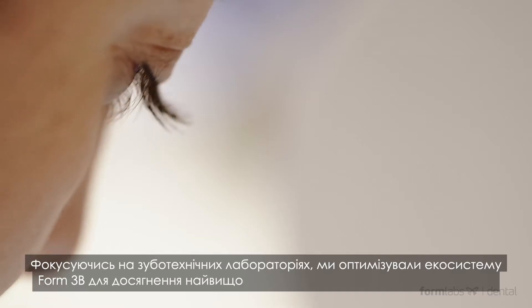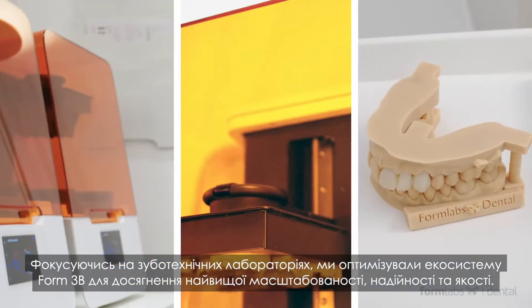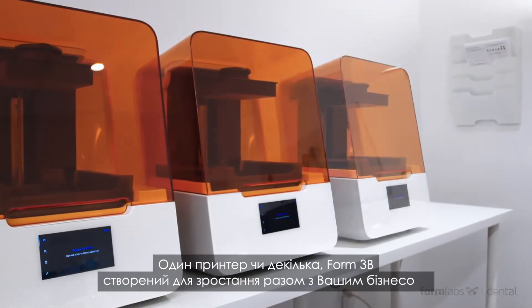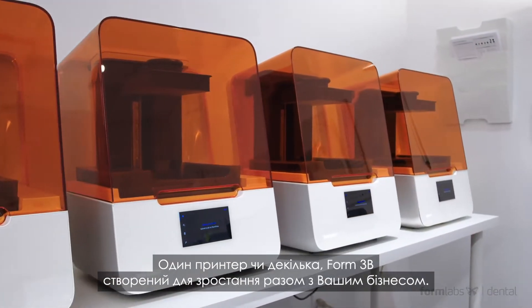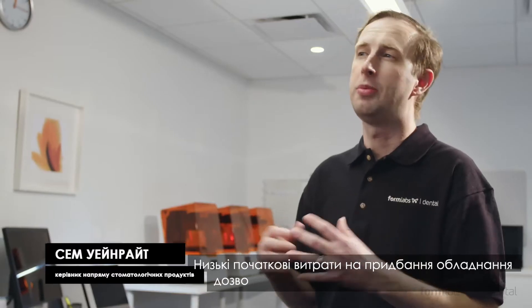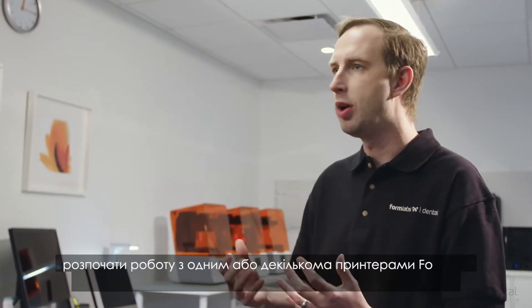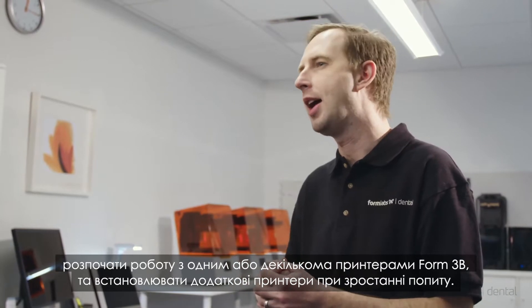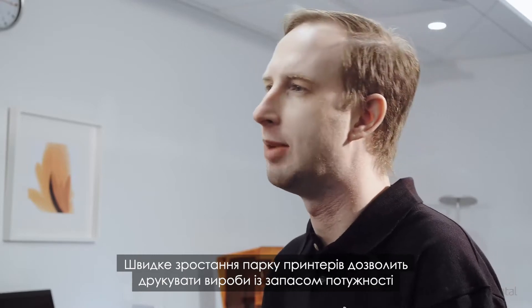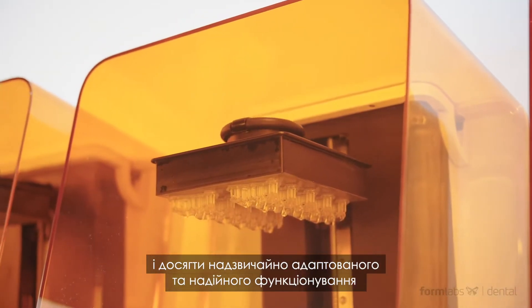With dental labs in mind, we optimized the Form 3B's ecosystem for ultimate scalability, reliability, and quality. From one printer to many, the Form 3B is built to grow with your business. The low upfront equipment costs allow laboratories of all sizes to start with one or a few printers and add capacity as demand grows, quickly growing a sizable fleet and building in redundancy for an incredibly scalable and reliable operation.